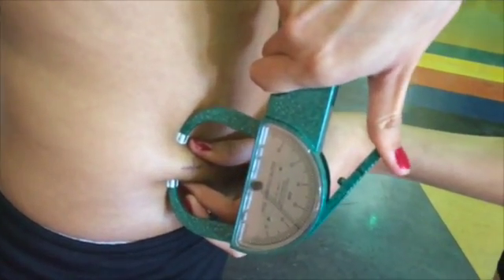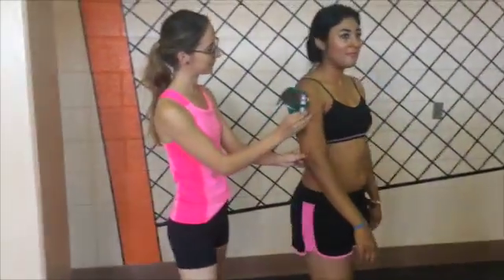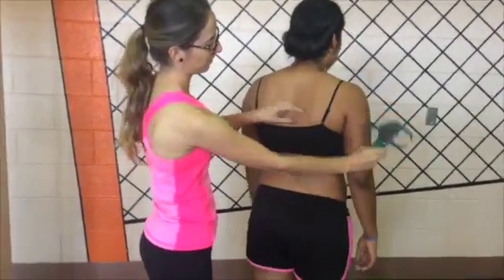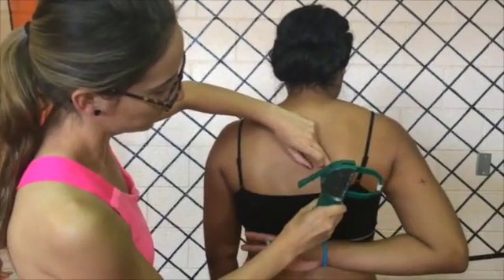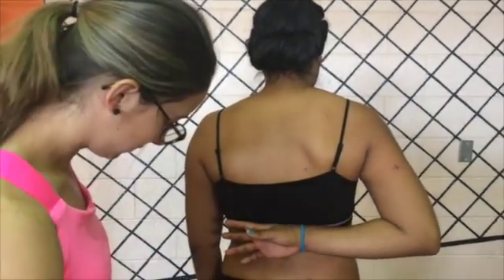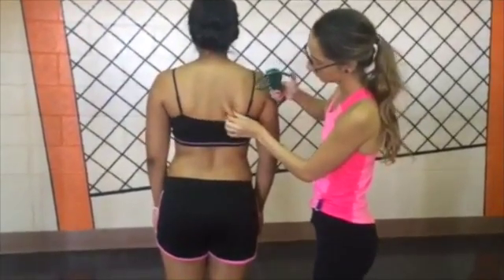The next measurement would be the subscapular fold. Tell the patient to fold their arm behind their back. Place a mark 1-2 cm below the inferior angle of the scapula. Take a diagonal fold and measure.